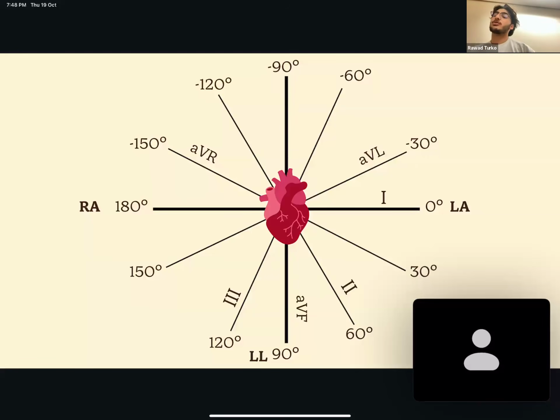Well, no, because in the example that you just gave, we're looking at 2 negative electrodes, but in the bipolar leads, as you can tell from the name, bipolar, 2 poles, 2 electrodes, we're looking at just 1 negative electrode. So if we put the negative electrode on the right arm, that's your negative electrode. It's right there. You're just looking in a straight line. You're not looking into the resultant vector of anything because it's just 1 electrode.